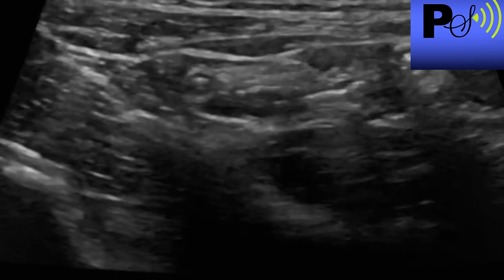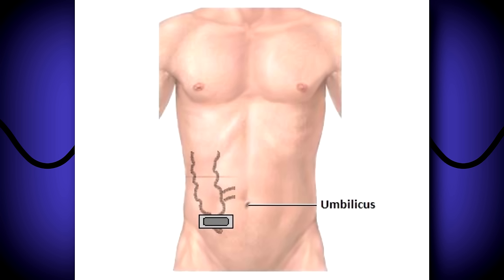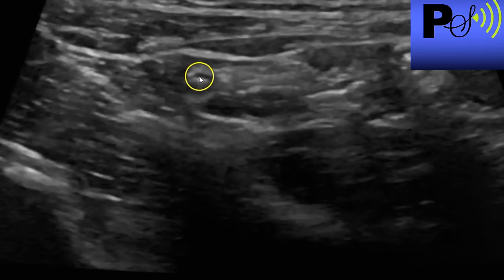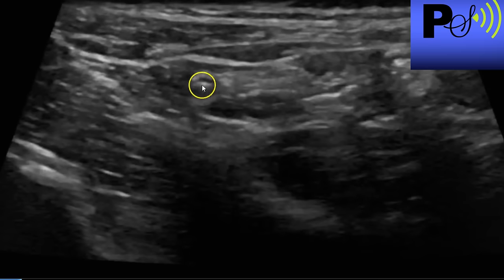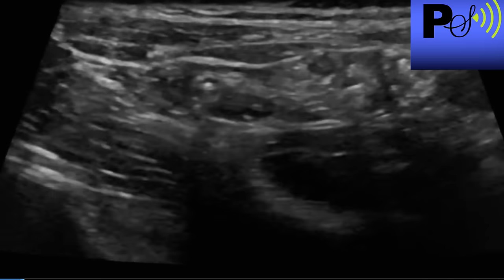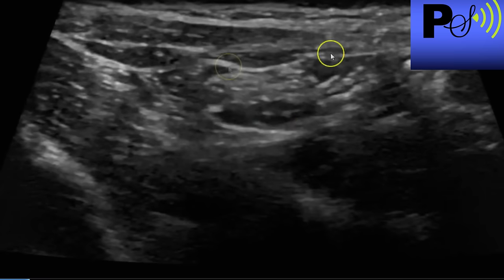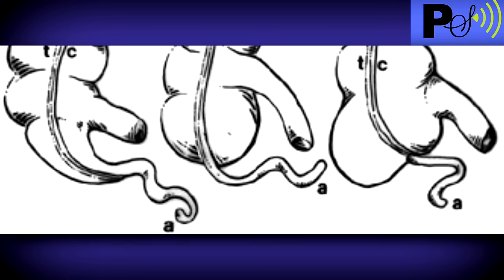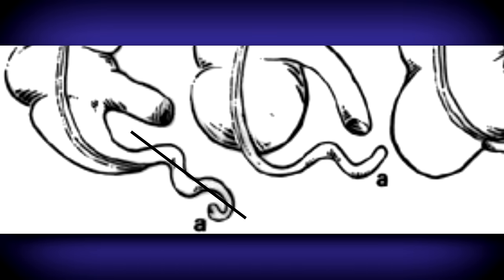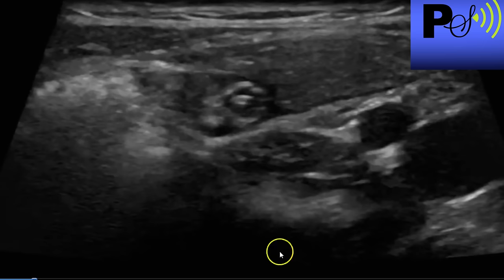Scan a little bit down and then right here, just below the cecum, you have the appendix. As you can see, this is the appendix right here — these three circles, that's the appendix. And there it is again.